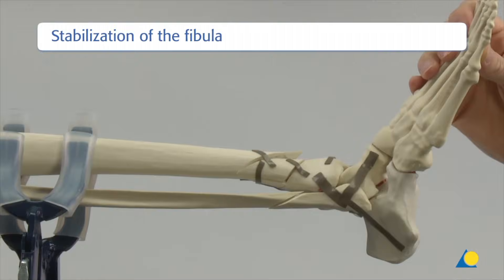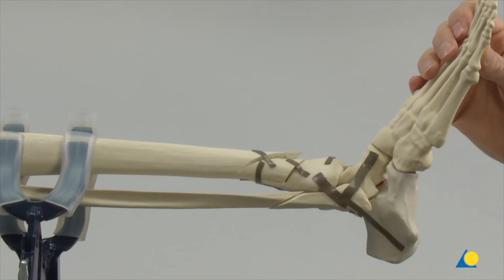After the bone model has been positioned in the clamp, the first step will be to use the lag screw technique to reduce and fix the simple fracture of the fibula. In doing so, the displaced anterolateral fragment of the tibia will be reduced indirectly due to the anterior syndesmotic ligaments, which are usually intact.